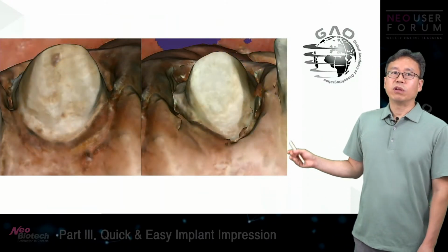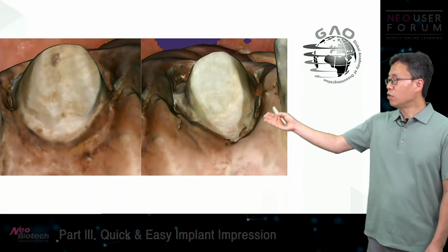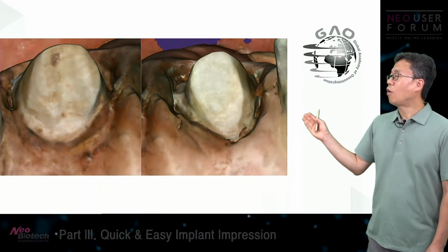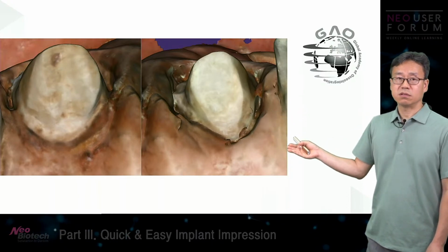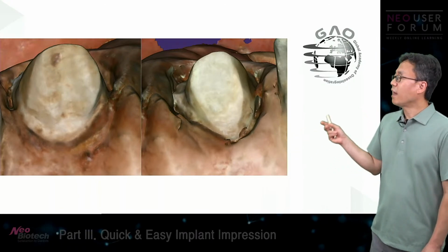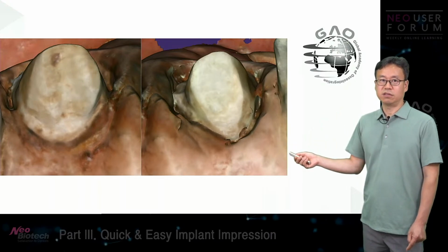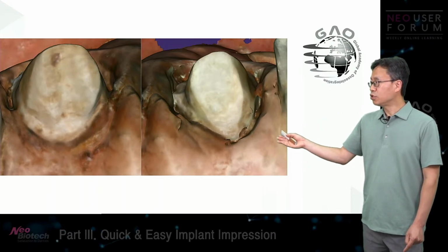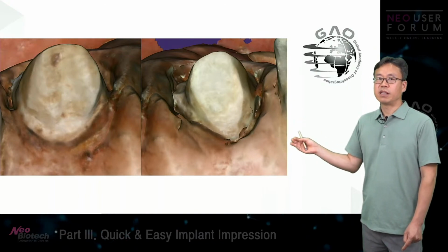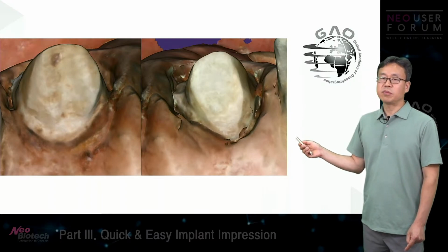But when we look closely into the detail of the margins of those abutment teeth, you can hardly see the margins. Can you? Here's the agony of the lab technician. How could he or she make well-fitting crowns based on this data? Probably not possible.